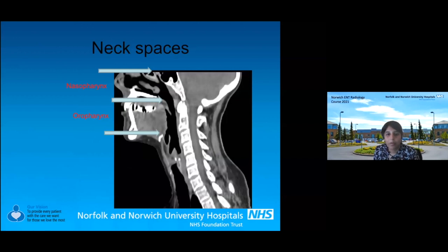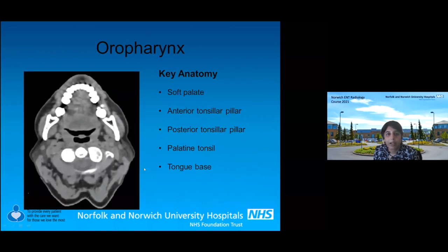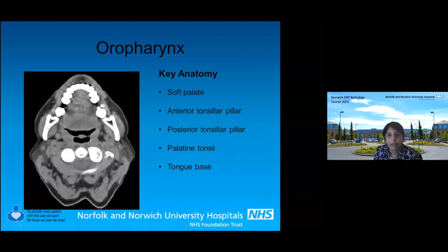Moving on to the oropharynx — from the soft palate to the hyoid bone. Key anatomy on CT includes the soft palate including the uvula, the anterior tonsillar pillar and the posterior tonsillar pillar — these are actually muscles, part of the soft palate — and then the palatine tonsils and tongue base.